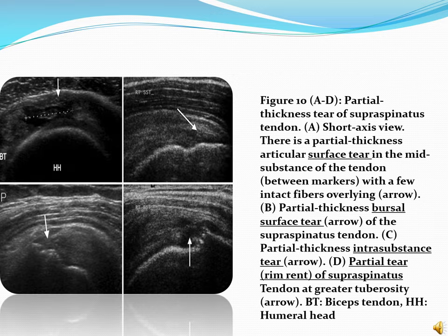This image shows partial thickness tears of the supraspinatus tendon. Image A shows a short axis view with a partial thickness articular surface tear in the mid-substance of the tendon with a few intact fibers overlying. Image B shows a partial thickness bursal surface tear of the supraspinatus tendon. Image C shows a partial thickness intra-substance tear. Image D shows a partial tear of the supraspinatus tendon at the greater tuberosity.